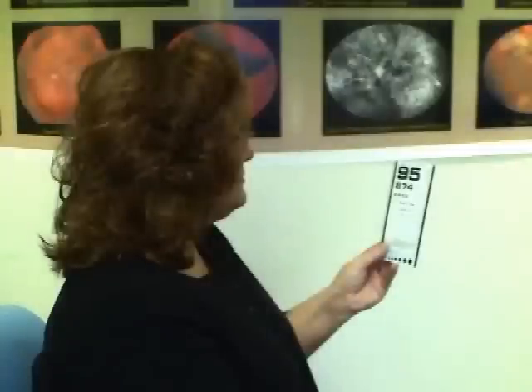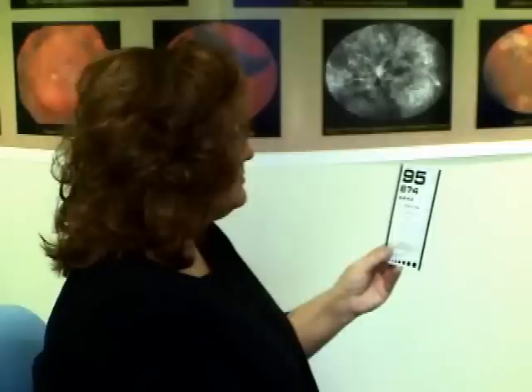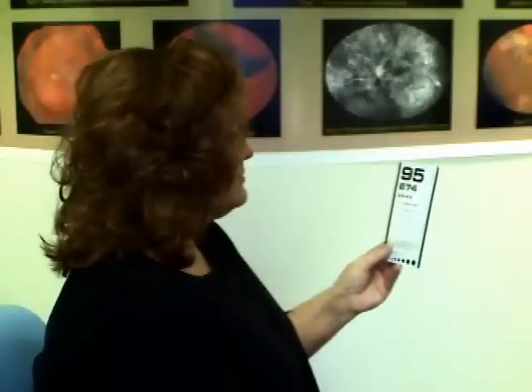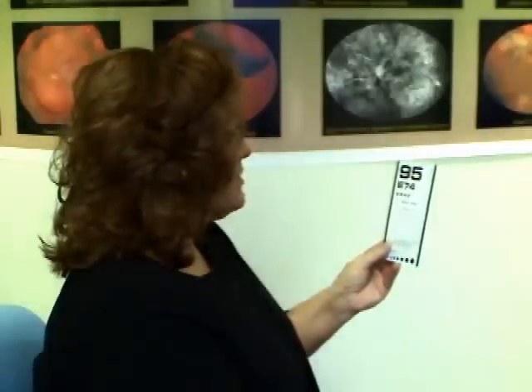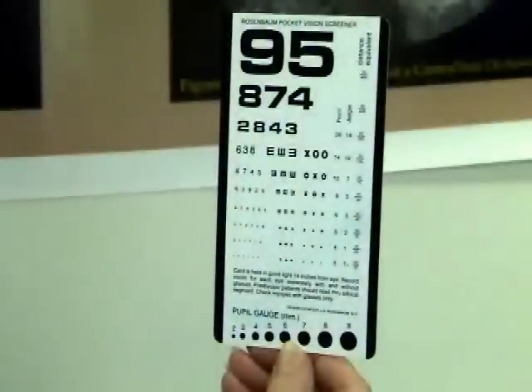You can test visual acuity with a near vision card, but it is not nearly as accurate as using the Snellen distance acuity chart, because it is easy to misestimate the proper testing distance. The near vision card contains letters or numbers that are scaled down for testing at a distance of 14 inches or 36 centimeters from the eyes.